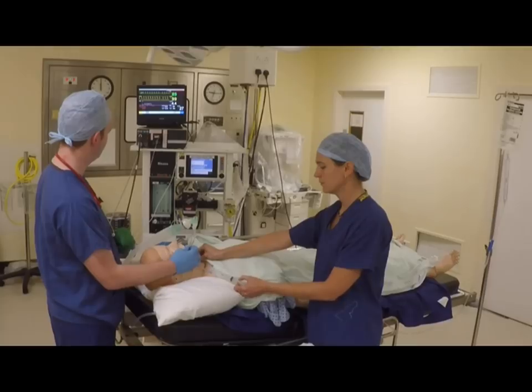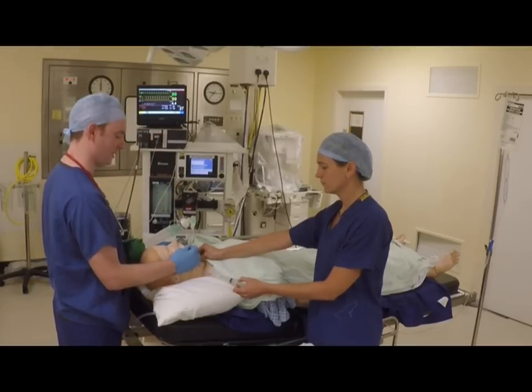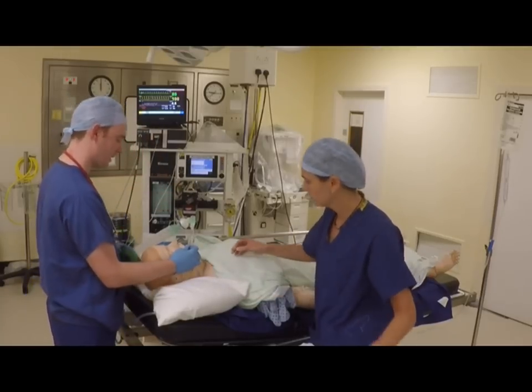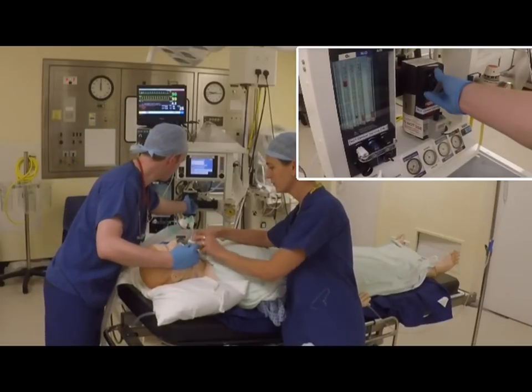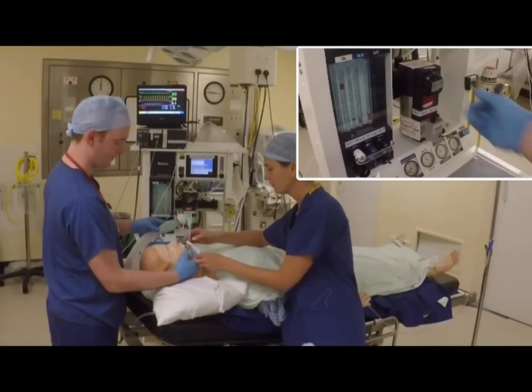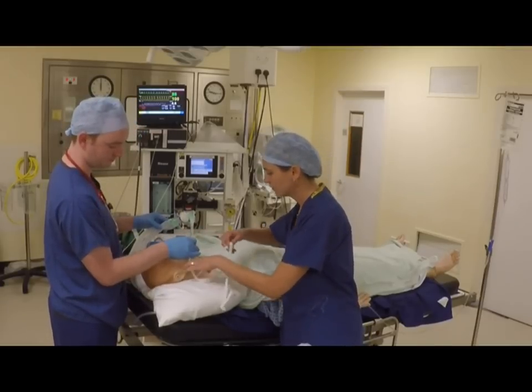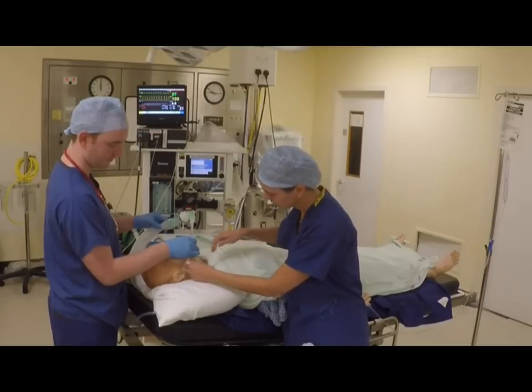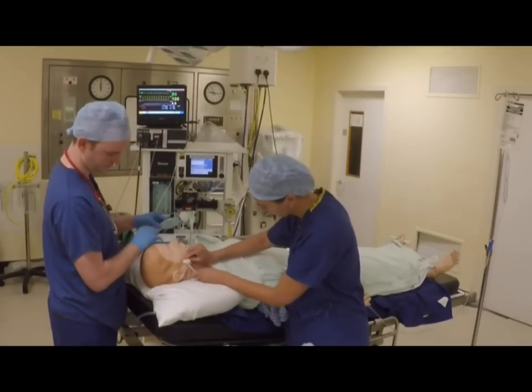Following confirmation of position and the lack of leak, the anaesthetist then instructs their assistant to remove the cricoid pressure and the endotracheal tube can be fixed in position with the tube tie. The vaporizer must be turned on in a timely fashion to avoid awareness following redistribution of the intravenous drugs. A longer-acting paralyzing agent also needs to be administered as the suxamethonium wears off.